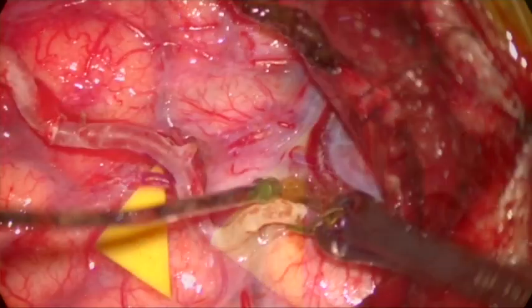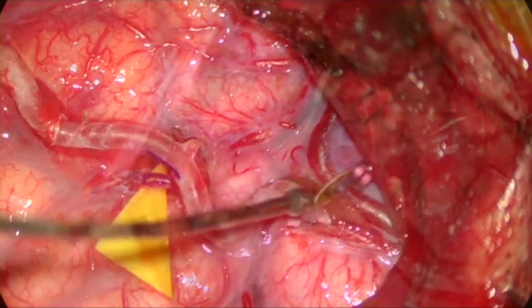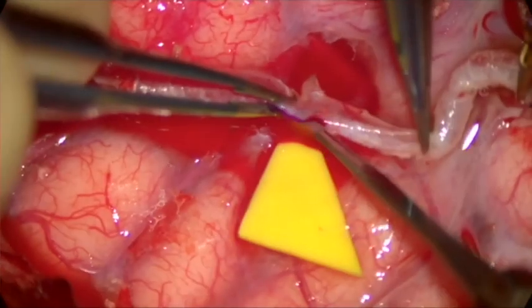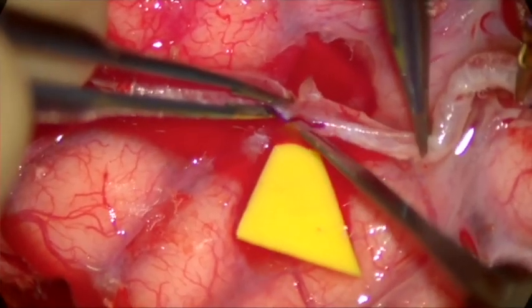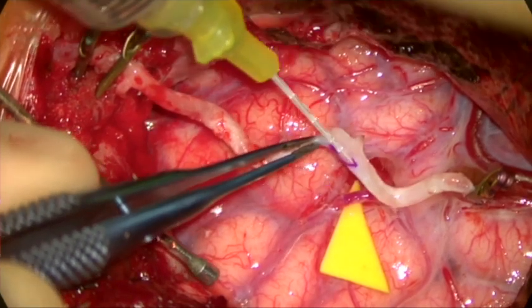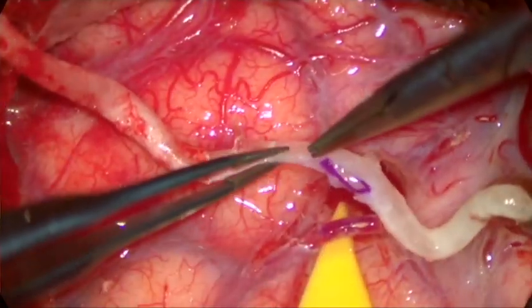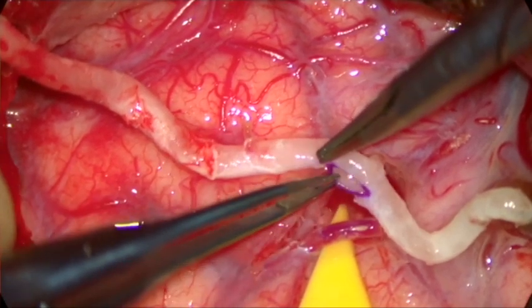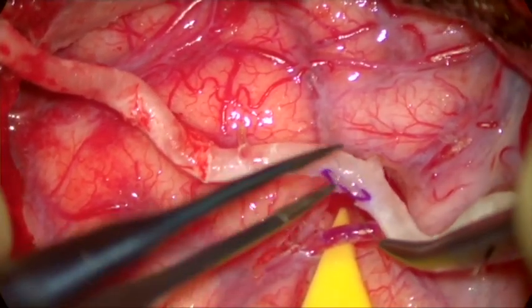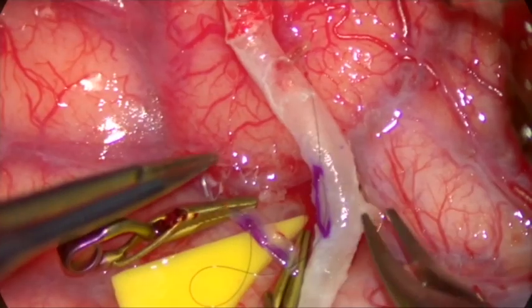This is now a side-to-side anastomosis between the STA and the temporal M4. After clamping the STA distally, I open the side of the STA, irrigate it thoroughly with heparinized saline, making sure no residual blood is inside the lumen. And in this instance, we will have to use a running technique because it is side to side.